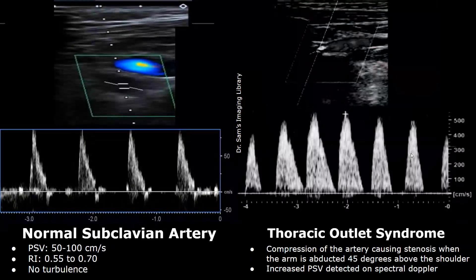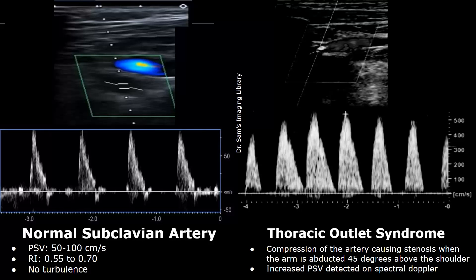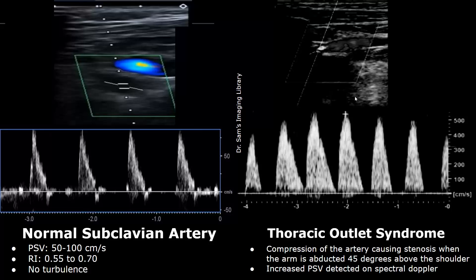Thoracic outlet syndrome refers to compression of the blood vessels and nerves in the space between the collarbone — that is the clavicle — and the first rib. The subclavian artery can be compressed in such cases. It usually occurs in the setting of trauma or injuries. Doing certain activities with the arms may cause compression. At rest the subclavian artery will be normal, but when the arm is raised and abducted 45 degrees above the shoulder, increased PSV is detected on spectral Doppler, indicating stenosis of the artery due to compression.